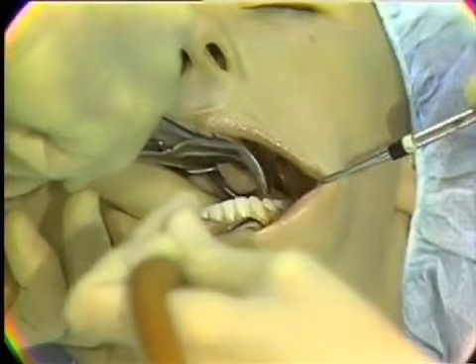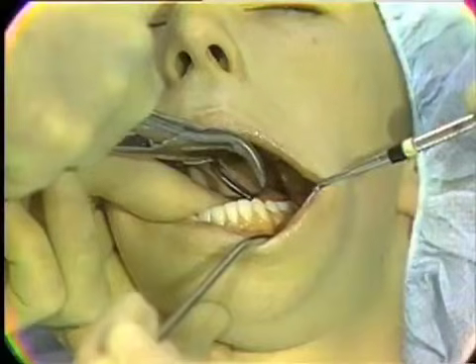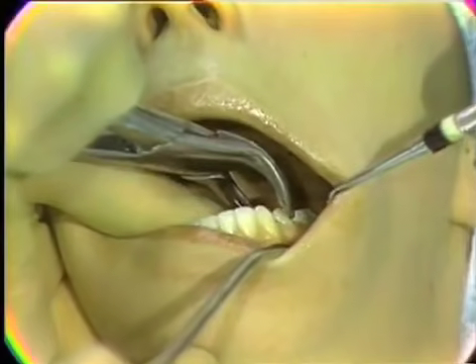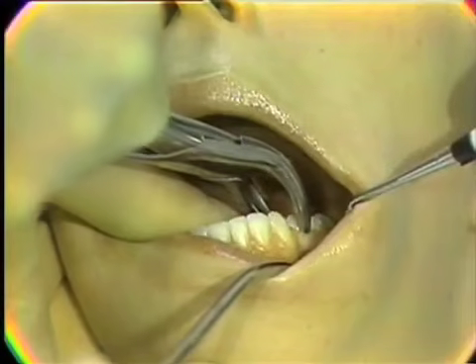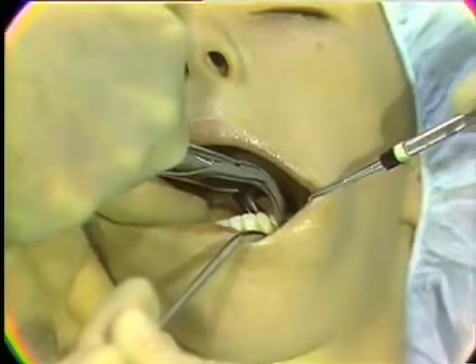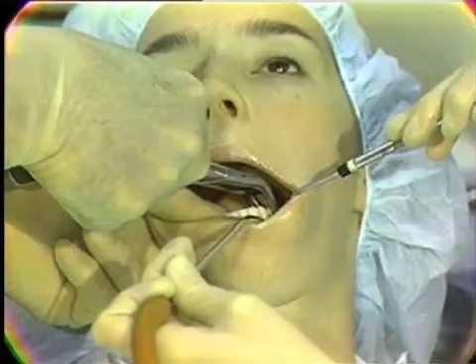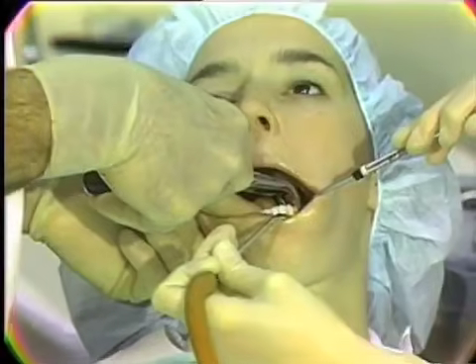We're quite careful in the application of the beak, watching where it goes, so we don't engage gingival tissue. So we only engage the tooth. We'll slide the lingual beak down carefully and watch it go into the sulcus, and then we would close the forceps slightly and slide the beaks down on the buccal. Then we would support the mandible securely, inform the patient that they will feel a good deal of pressure for a moment, and then we would begin the luxation of the tooth with the forceps.